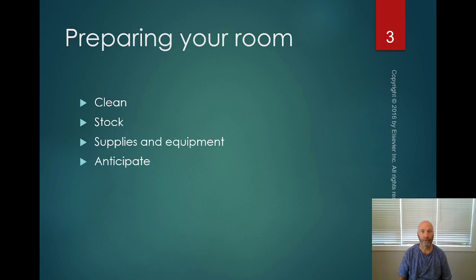Wipe everything down. If you're in an RF room, wipe down the control handles for the fluoro tower. If you're just in a diagnostic room, make sure you wipe the tube down, make sure you wipe the control panel down, certainly wipe the bed down, wipe down the wall bucky, everything that you might touch during the day. And then stock it with the supplies that you need. Going back to the room type, what supplies do you specifically need? What equipment might you need? So do you need maybe tabletop grids, tape-on grids, snap-on grids, those sorts of things?